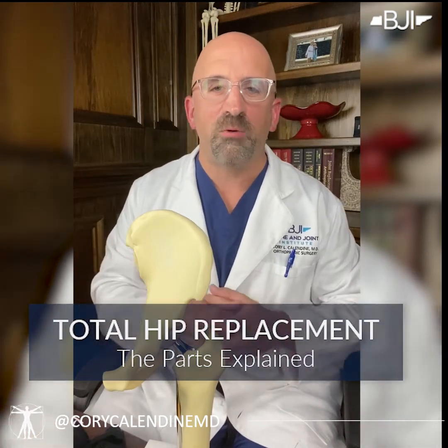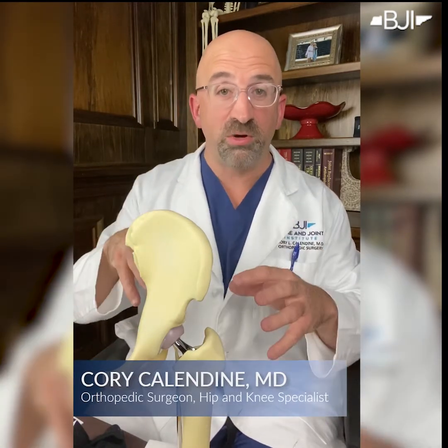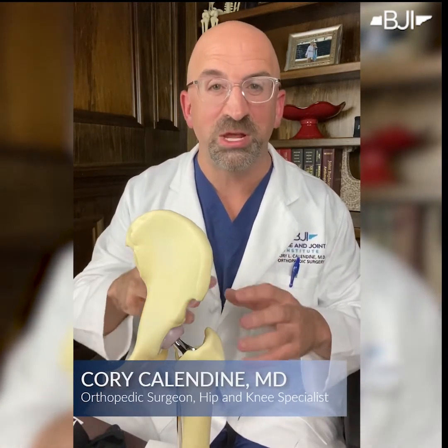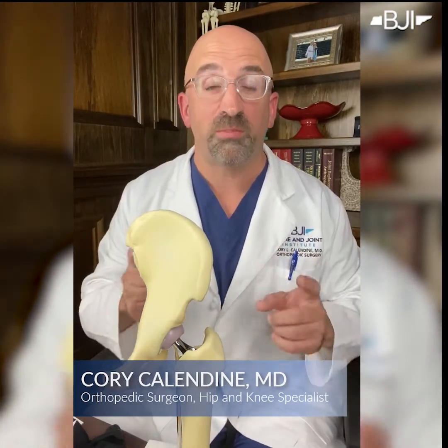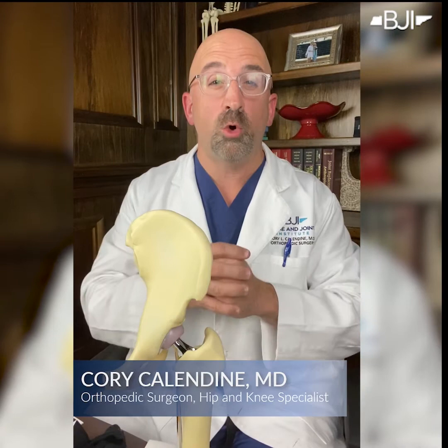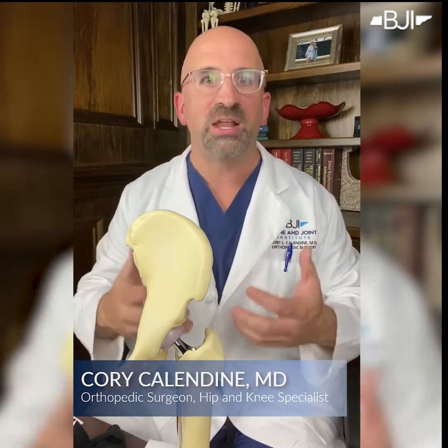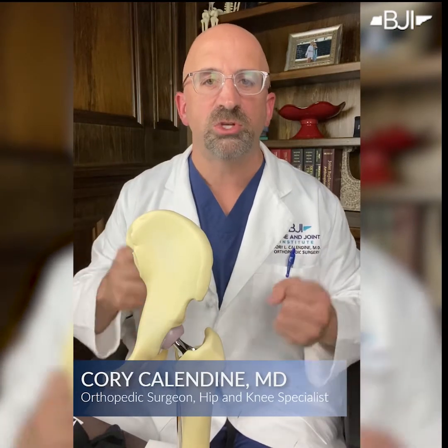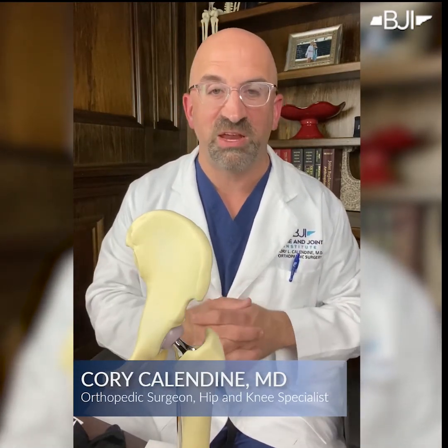Hey guys, I hope you're all well. I wanted to take a couple minutes today to talk about total hip replacement and specifically the components or the parts we use to rebuild a hip. Just like with arthritis of any joint, the problem with hip arthritis is bone on bone. And what we want to do is put artificial parts, metal and plastic in between, so there's no bone rubbing up against bone, because many of you know how very, very painful that is.